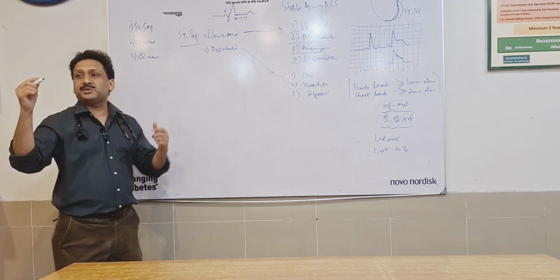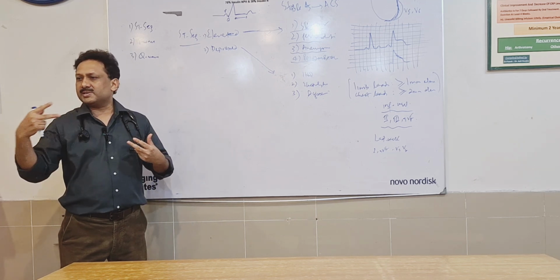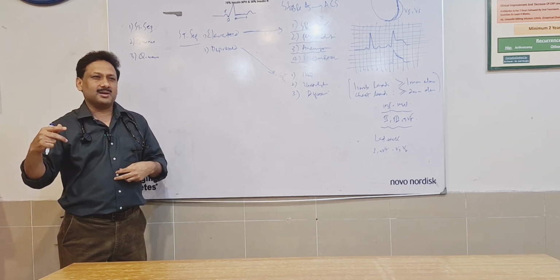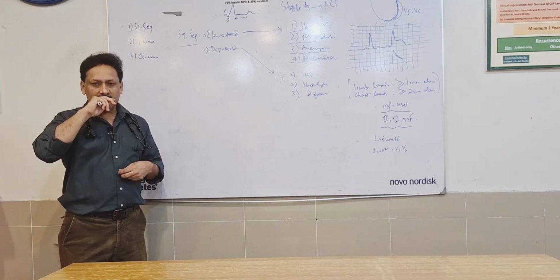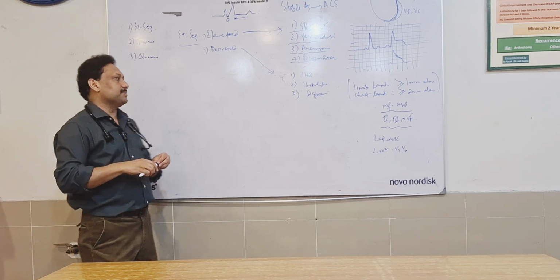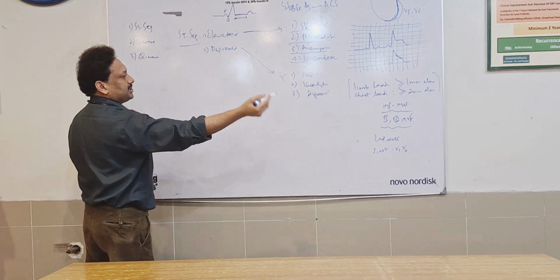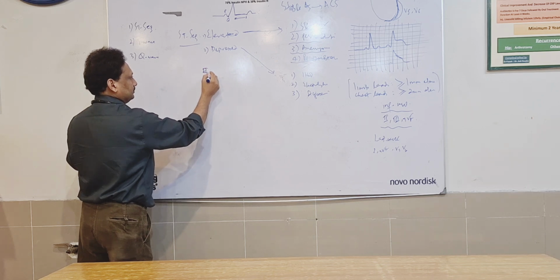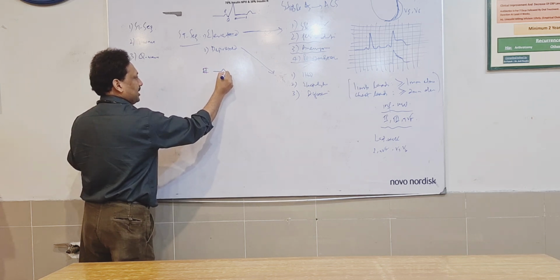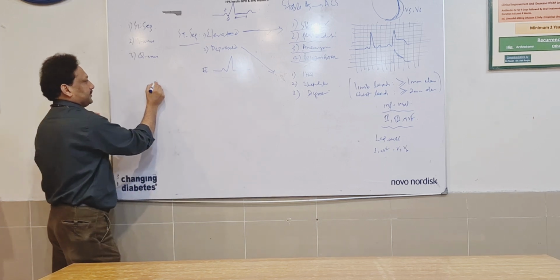These include, first, typical chest pain, second, drenching sweating, third, vomiting. These are considered the classical symptoms of myocardial infarction. I am just drawing an inferior wall here, lead number 2. That's the normal lead 2. What happened to that person?